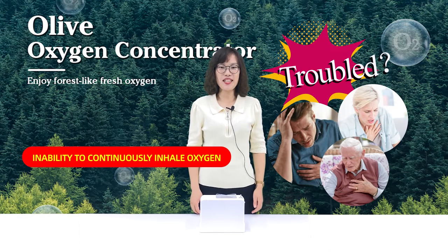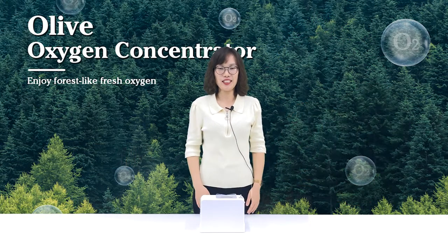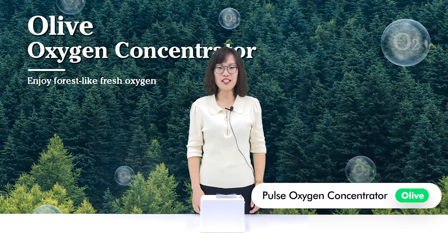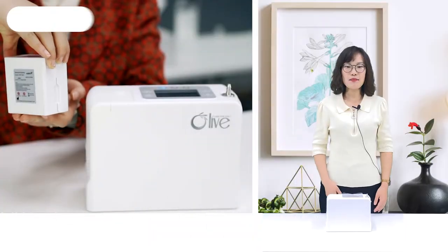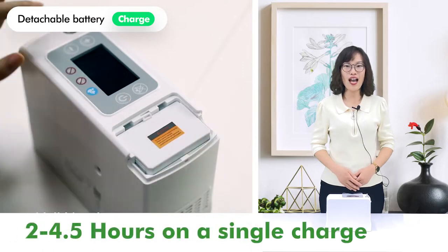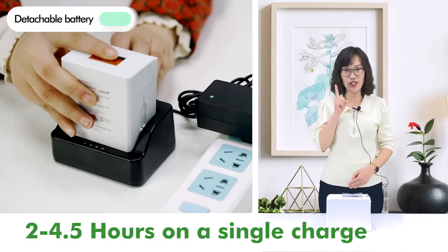Are you still troubled by the inability to continuously inhale oxygen when you go out? This 2.3 kg portable oxygen concentrator developed by Olive can help. This machine uses a detachable battery which can be used for 2 hours to 4.5 hours on a single charge.